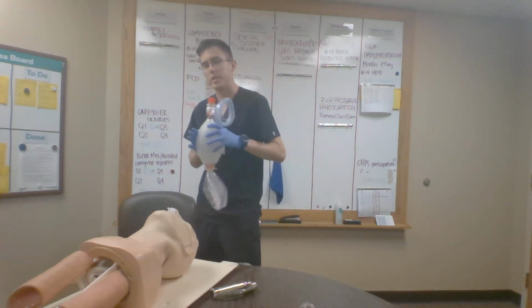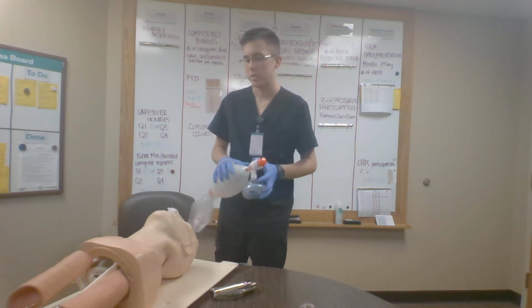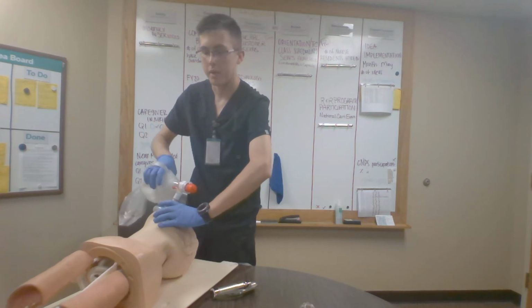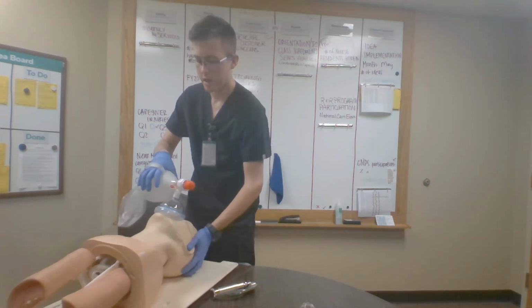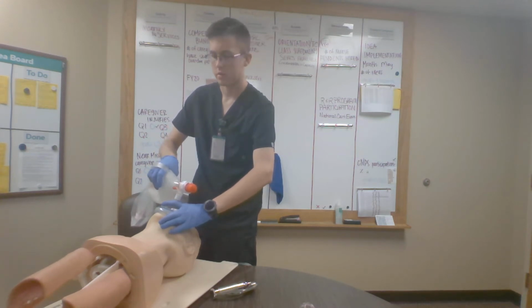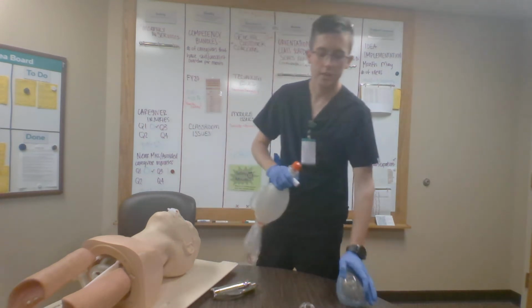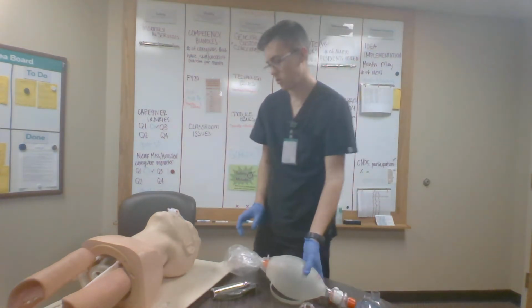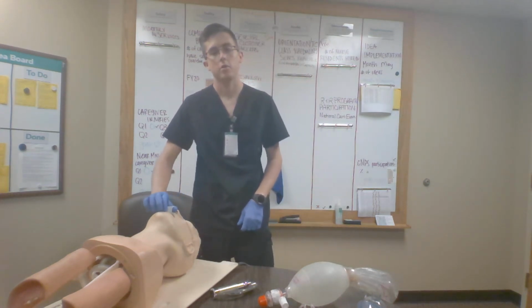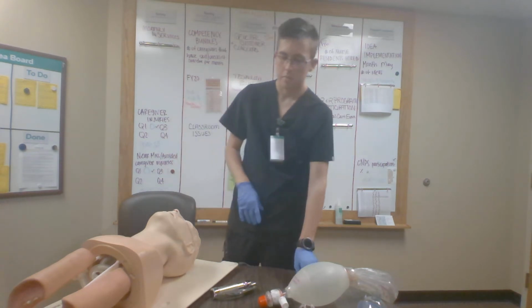Then I will take my BVM, attach it to oxygen. I will attach my patient to an SpO2 monitor. And then I'm going to ventilate my patient at a rate of 10 to 12 times a minute, evaluating for adequate chest rise and fall. And then once I notice that my patient is beginning to have an SpO2 above 94% and they have had enough time to be properly pre-oxygenated, I will get ready for my intubation attempt.